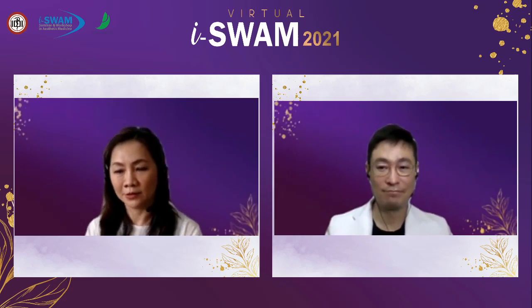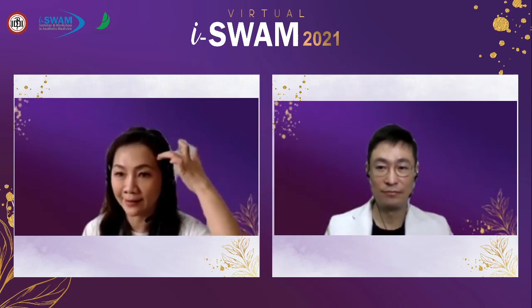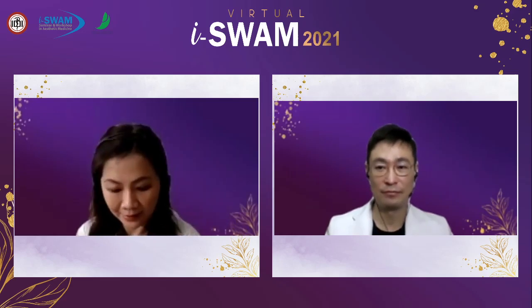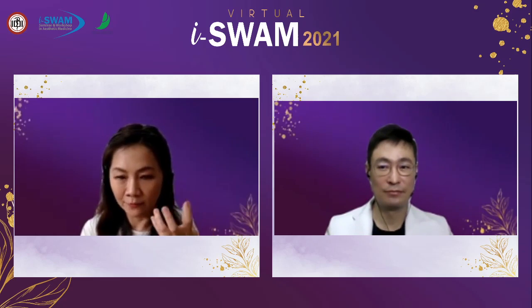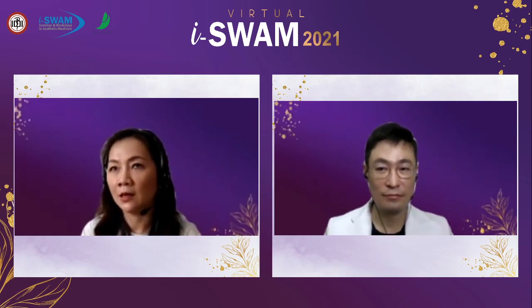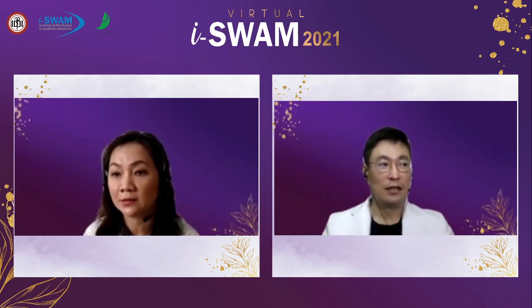Okay. So the end of the thread is above the hairline. Yes, that's right. Okay. So if we do the brow lift, how long will it last? The lifting effect for the brow, how long will it last?